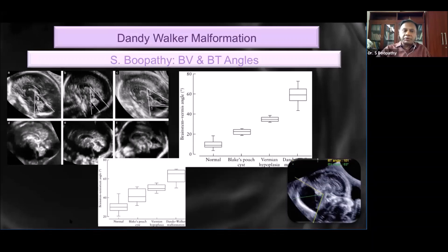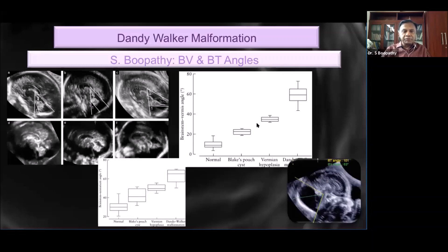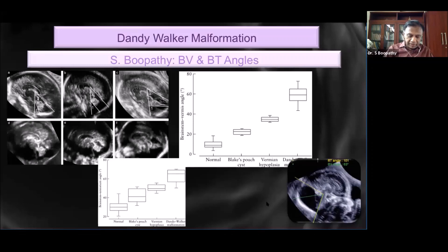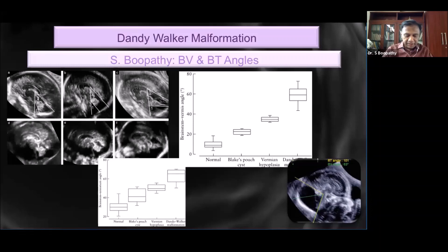The normal brainstem vermis angle is up to about 25 degrees. From 25 to 30 degrees is a borderline range, and 30 to 45 degrees is associated with vermian hypoplasia along with the morphology of the vermis. Above 45 degrees suggests Dandy Walker. To give specific values: Blake's pouch cyst is 23 ± 3 degrees, vermian hypoplasia is 35 ± 5 degrees, and Dandy Walker is 63 ± 7 degrees.